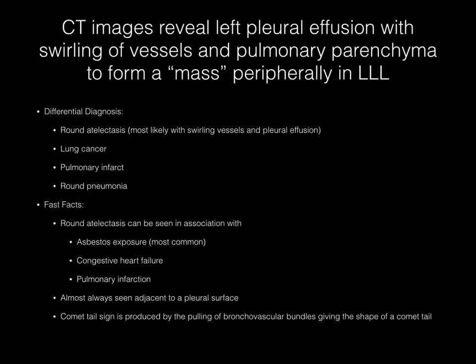This CT image demonstrates a left pleural effusion with swirling of the vasculature and pulmonary parenchyma to form a sort of mass peripherally in the left lower lobe. The differential diagnosis here should include round atelectasis, and this is the most likely diagnosis with the swirling of vessels and the pleural effusion. Also included in the differential could be lung cancer, pulmonary infarct, and round pneumonia, especially if it is a younger patient.